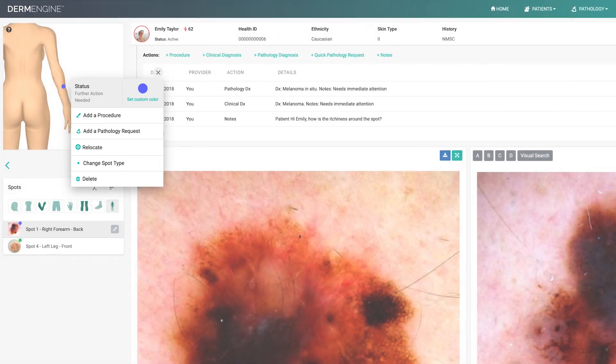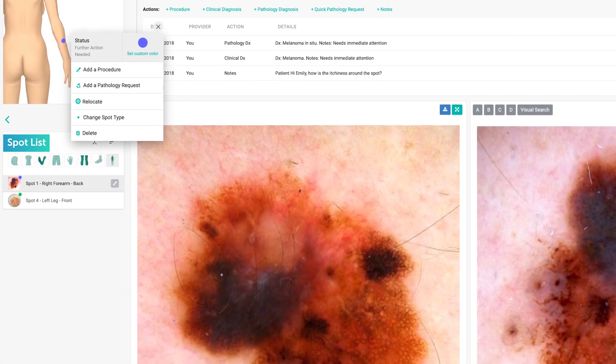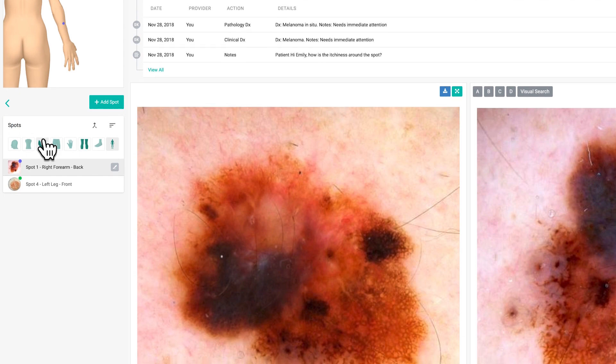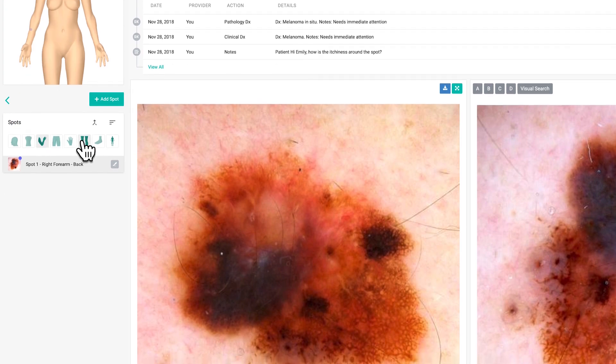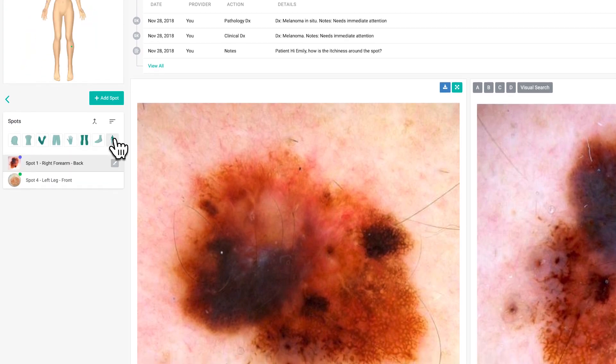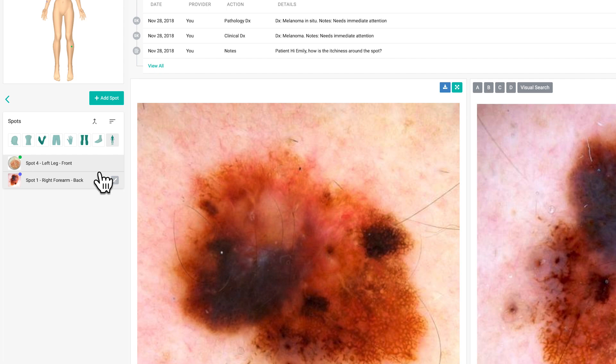Below the body map is the spot list, where all of the recorded spots for that patient will be. You can sort the spots by clicking the body icons. You also have the option of sorting by date created or last modified, depending on your preference so you can always locate the spot you are looking for.